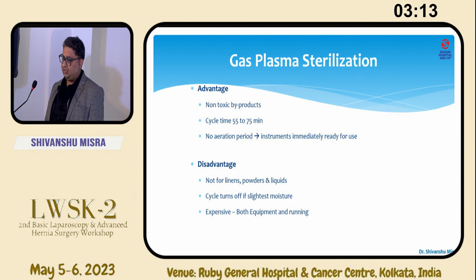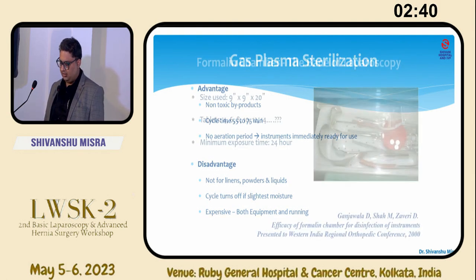The advantage again is that the products are non-toxic. The cycle time is not as high as ETO, just 55 to 75 minutes, like a mini autoclave. And there is no aeration time, because in ETO we need aeration to remove the toxic things and carcinogen, but in Sterrad we don't need any. The disadvantage is that it is very expensive, and it is not used for linens, powder or liquid. Even at the slightest moisture, it will just turn off. So we have to make the environment totally dry if we use Sterrad.